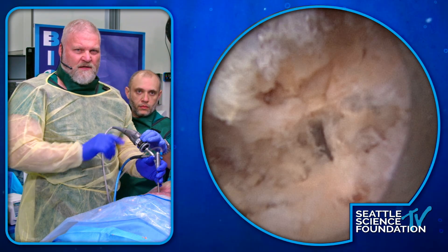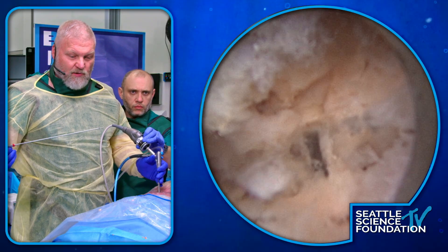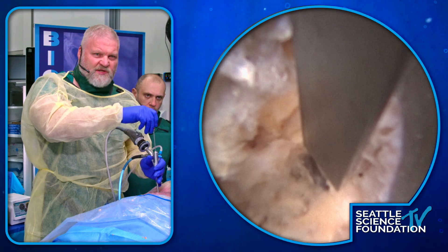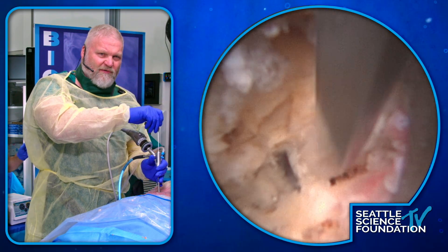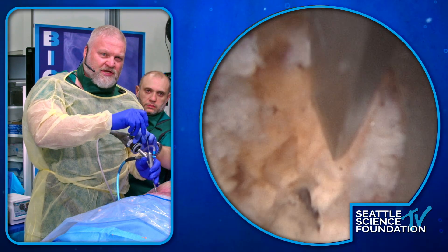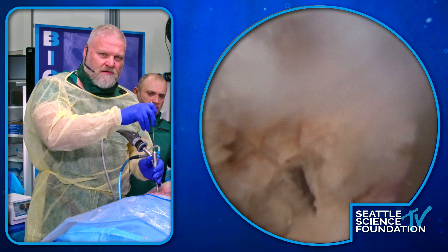All right, so this looks like some bone here — I have no idea where we are. It looks like Chole was doing some trimming, so this is sort of whatever level this is at — this is like the leading edge of the lamina here, with the ligament attaching right here.